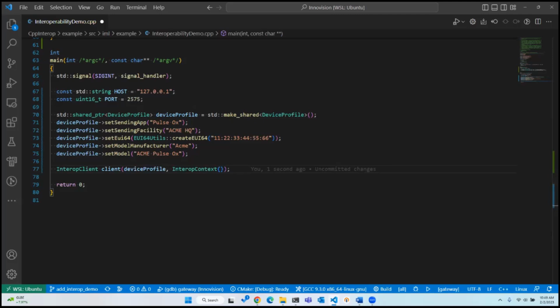So the default objects used by the interop client are all customizable. One example of this would be our network socket factories. You could decide which type of socket factory you would like to use. And all of those components, those objects set on the context or the client, are all extensible. So you could create your own and define your own way to create network sockets. This principle is applicable to all of our components and all of the objects that you can set on this context and this client.